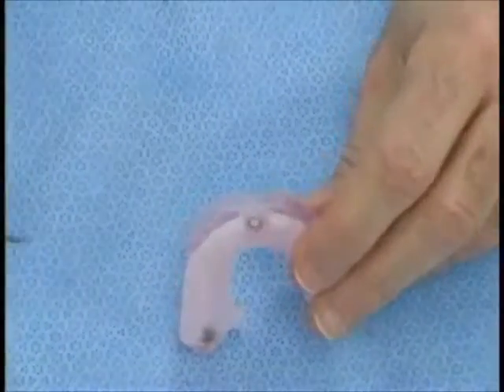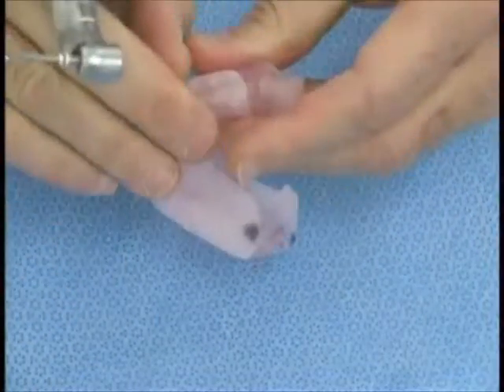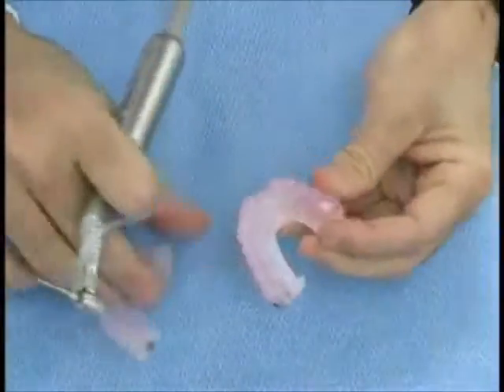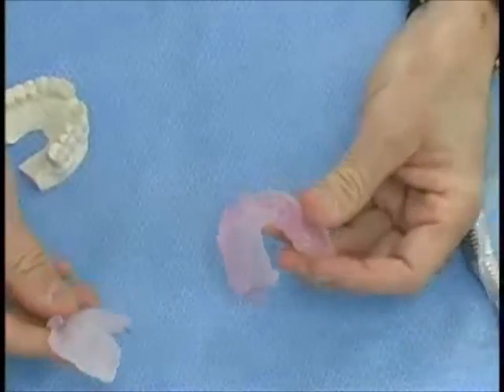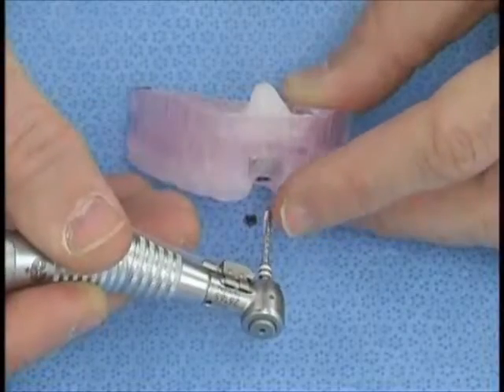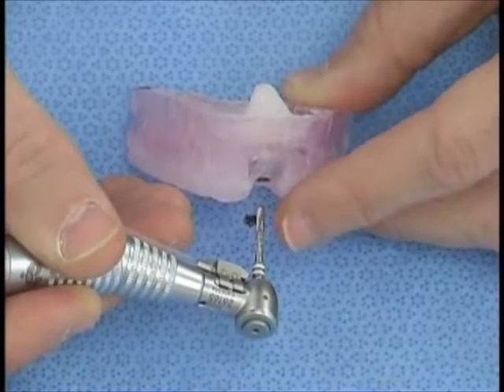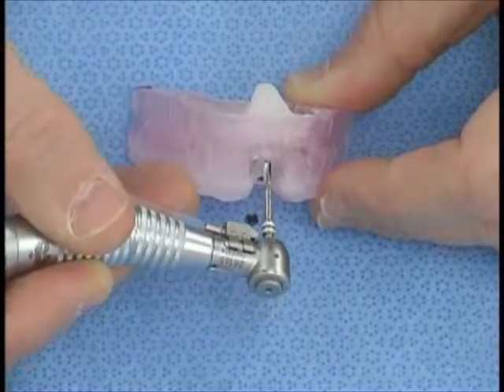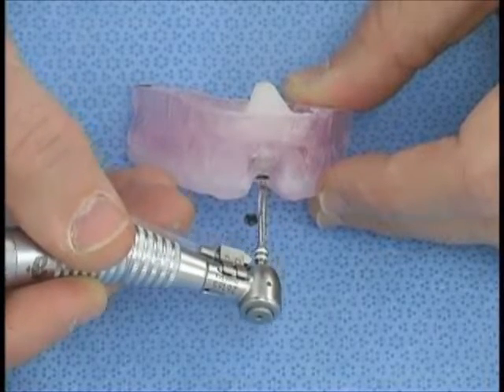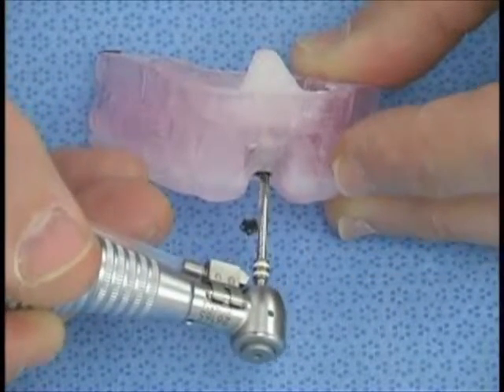So just to get started, we have to make sure that the stent fits well. And you can see that it does in this case. We have to make sure that the stent fits properly. For this exercise, we're actually going to utilize an 11 millimeter implant. So we're going to do 11 plus the 5 millimeters for the titanium tube, that's 16 millimeters. And then we can play around between 2 to 4 millimeters in terms of transgingival.